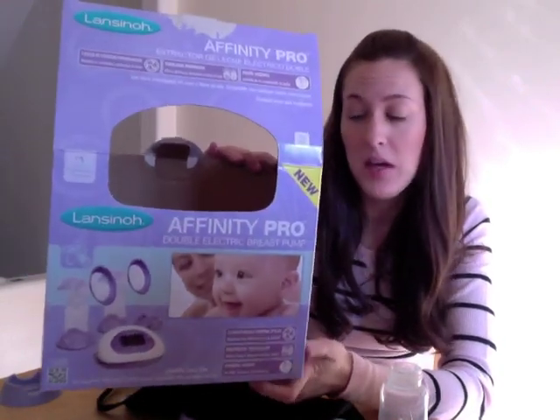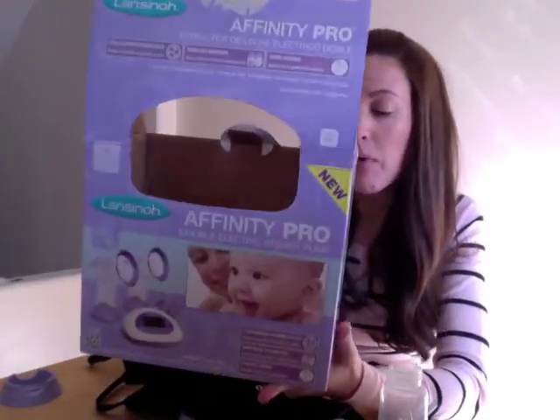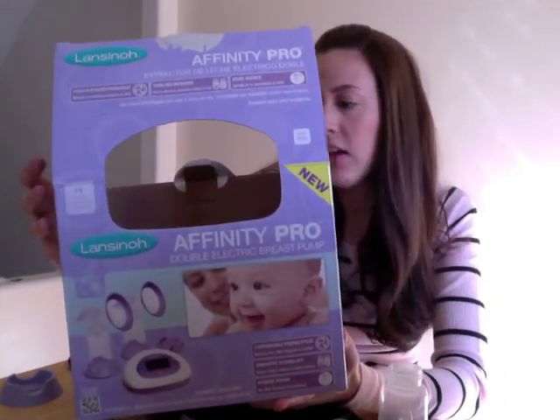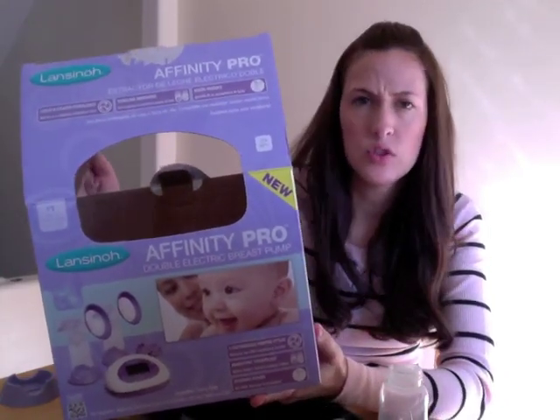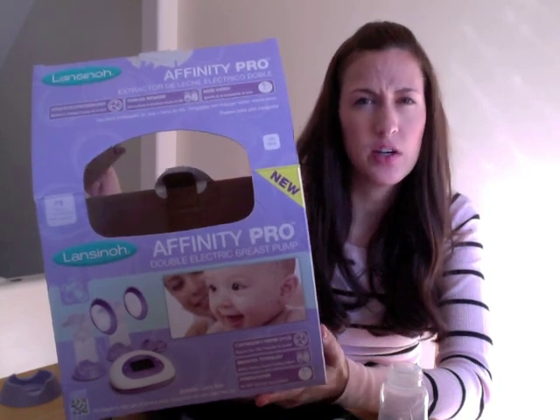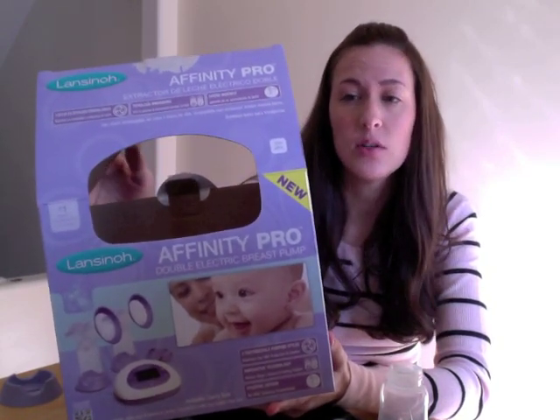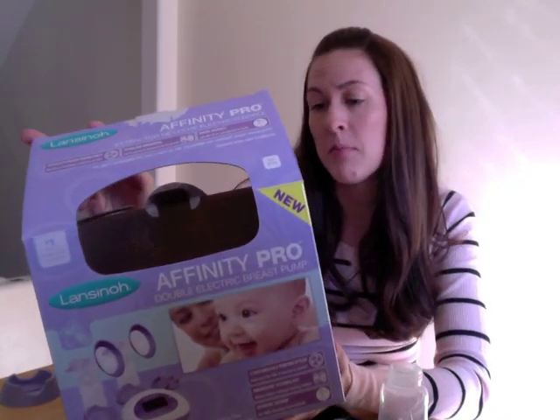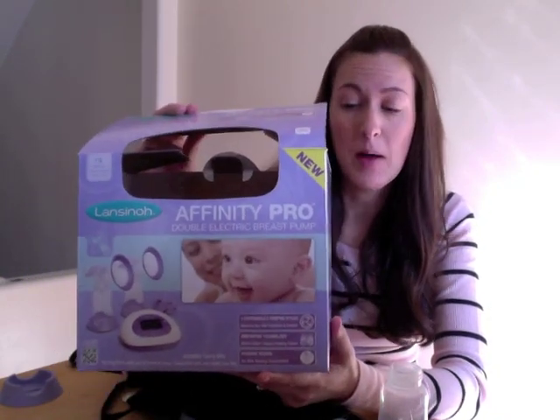It's the Affinity Pro — it's BPA free and it's a double breast pump, and I'm pretty excited to try it out. I think it retails for around $129.99, right around that range. So it's actually a more affordable breast pump than some that are out there for an electric double pump.